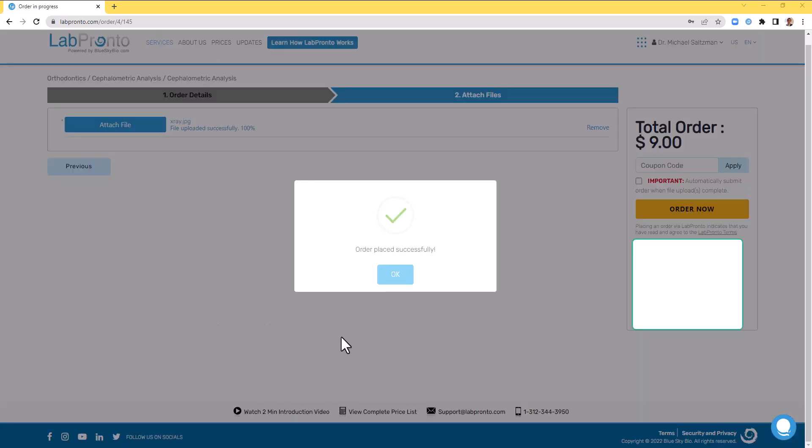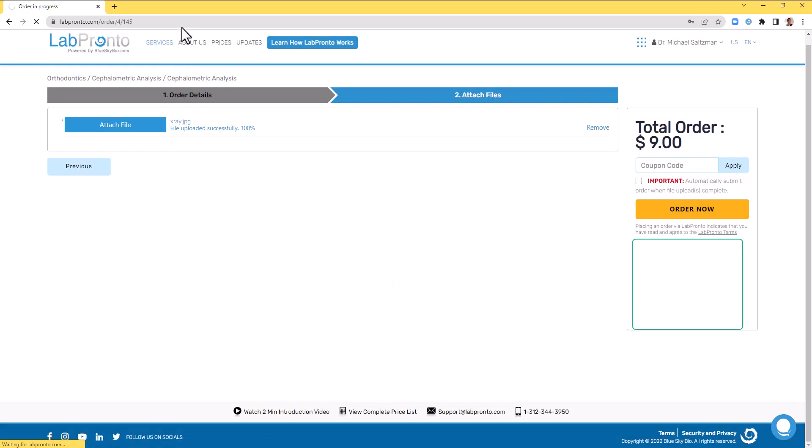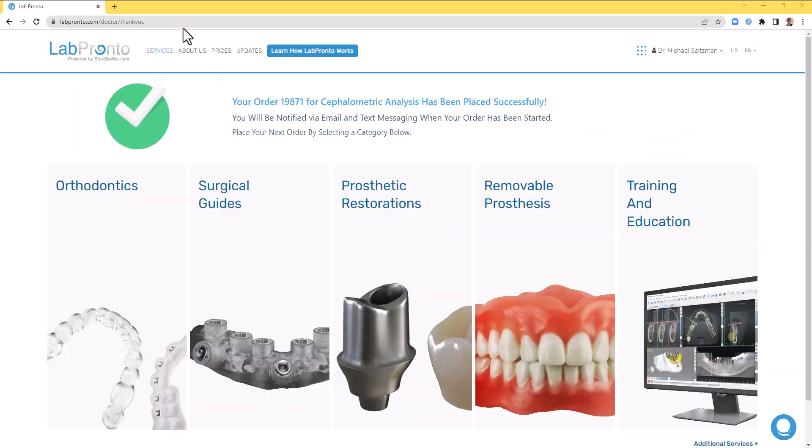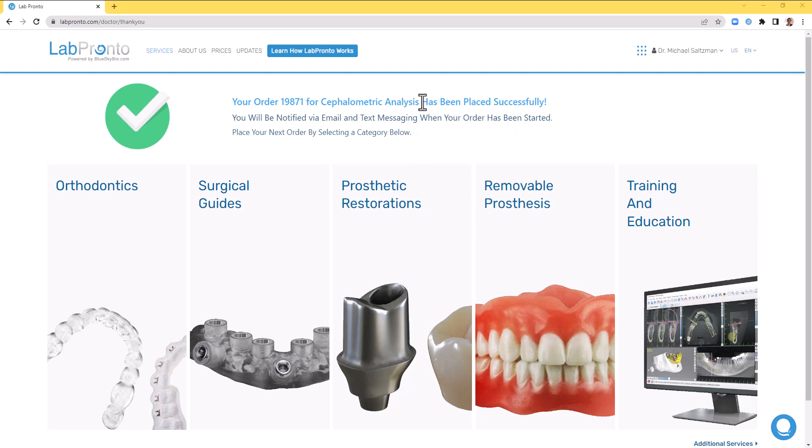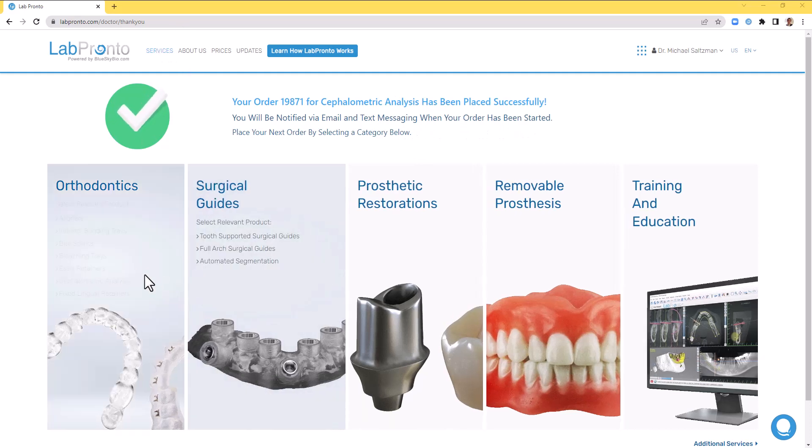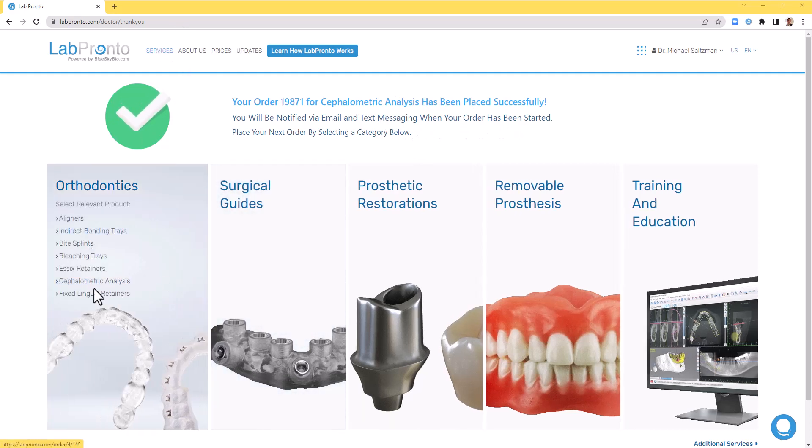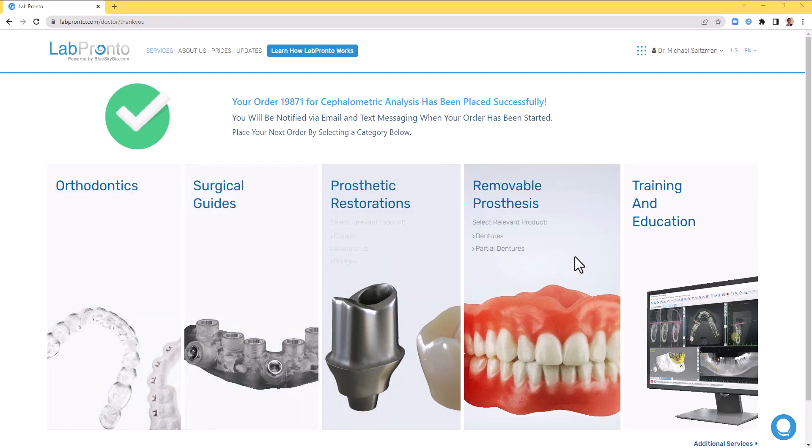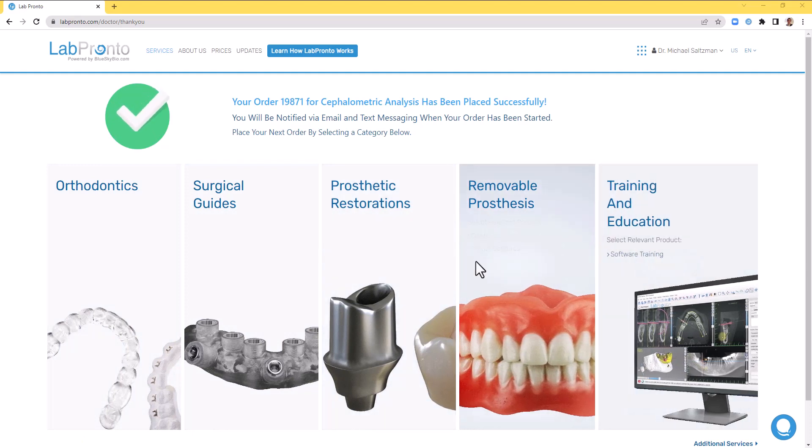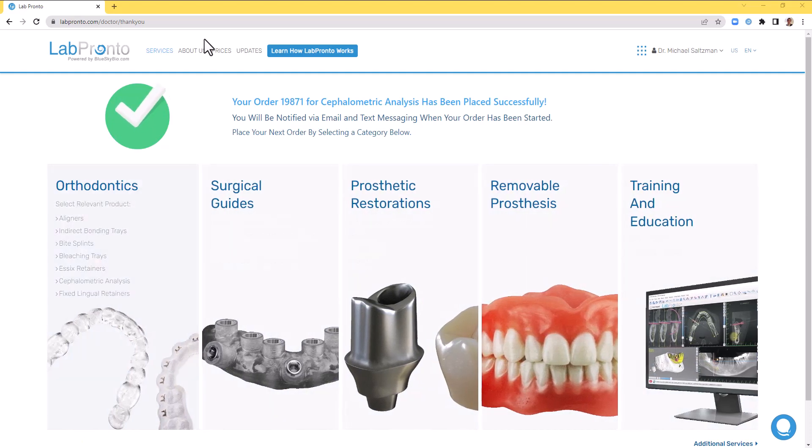Confirmation: order placed successfully. And we can see the message. You'll be notified by email and text message when your order has been started. At this point, you can go ahead and place your next order without interfering with the processing of the order that you have just placed.